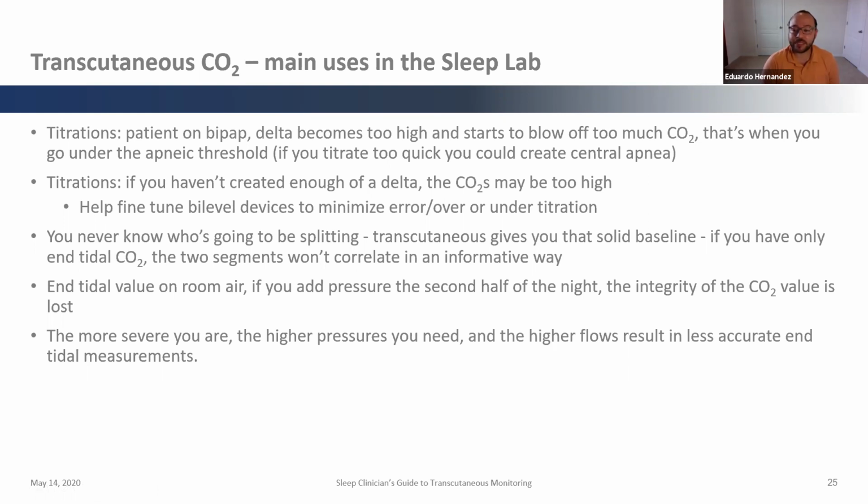Many times techs will hear, don't titrate too quickly, you'll create central apneas, or be careful, that kind of thing. And it's mainly because of that reason. Either they're not getting used to the pressures if you're on CPAP, or if you're on BiPAP, you've increased that pressure support too much, where now their body is blowing off so much CO2 that they stop breathing. So the CO2 accumulates and keeps rising inside the body before you can blow it off again. That's why transcutaneous is really important to monitor this.